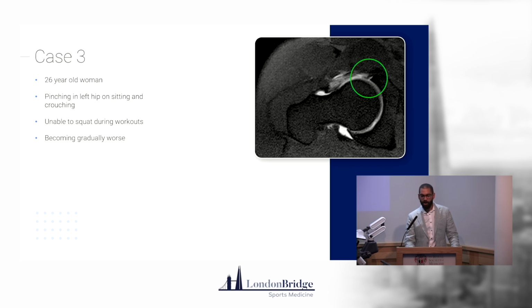Correct me if I'm wrong, anyone, but I think MRAs are a bit outdated now. If you've got a good 3T with good views and you ask for specific views of the labrum, there are lots of different protocols out there, but axial oblique views are generally quite good for the labrum. You can get enough information about the labrum to help your decision. I think there's no point putting someone through an injectate. Maybe if you're doing preoperative planning for a labral repair you might want it, but for me, I would never organise an MR arthrogram of the hip.